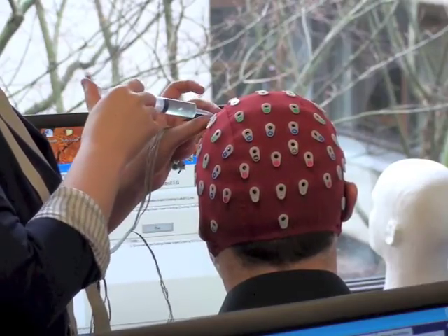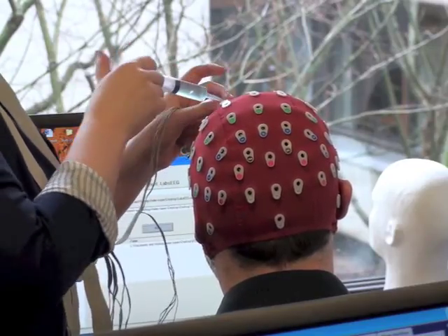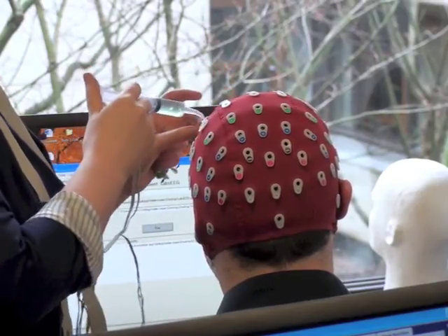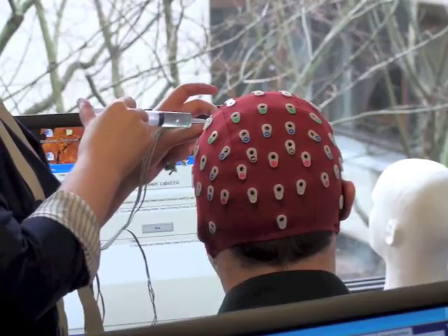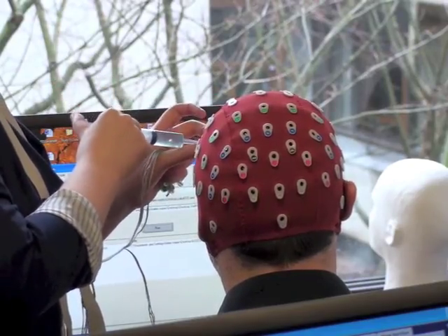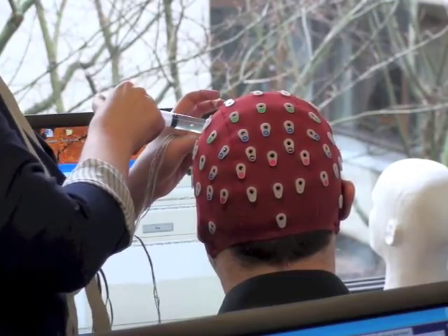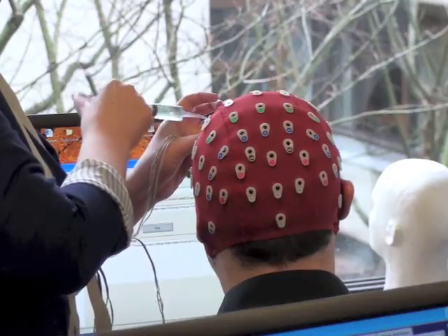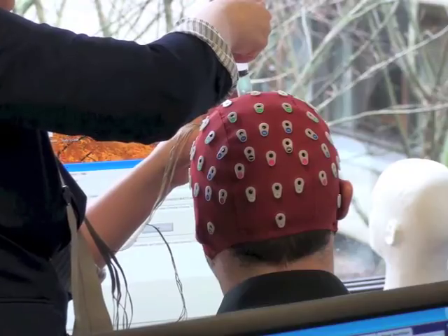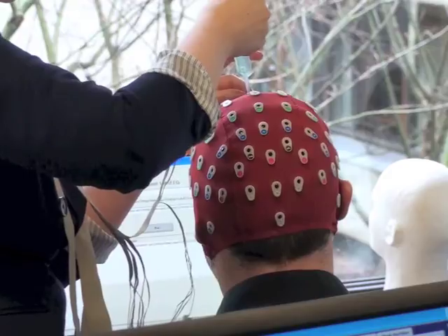It's very frustrating because sometimes you can spend a lot of time setting up, organising a participant, getting the stimuli ready, and then realise it's just not working when you press record. And it happens quite a lot. I tested, I think, 35 participants to get 19 participants' data. Wow. And it's quite common. I thought that was just me for a while, but apparently it's quite common that you just lose a lot of data and you don't know why. Okay, nearly done with the left-hand side.